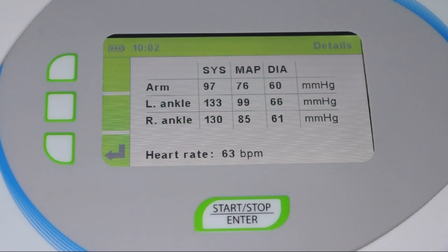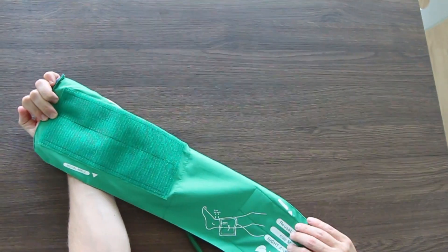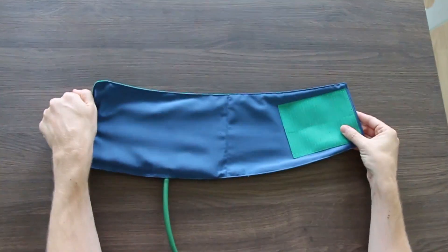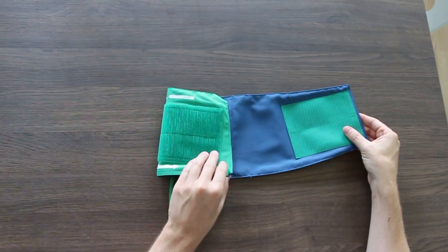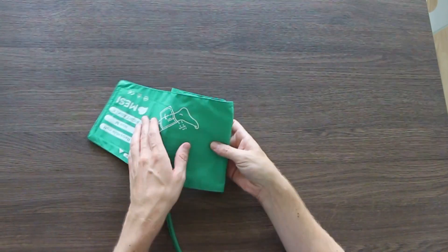Hold the cuff so that its inner side is turned up. First fold the smaller part in, and then wrap the other part loosely around it.